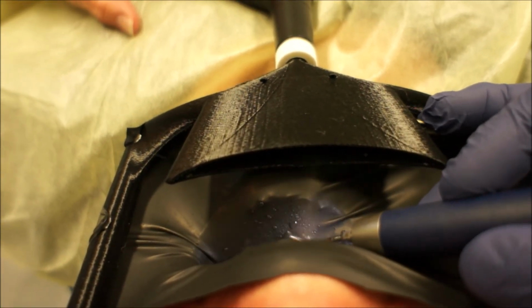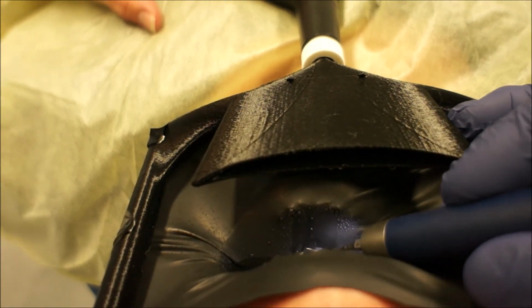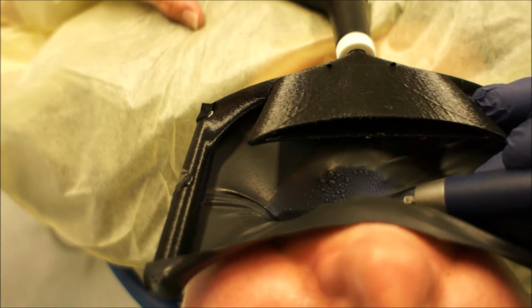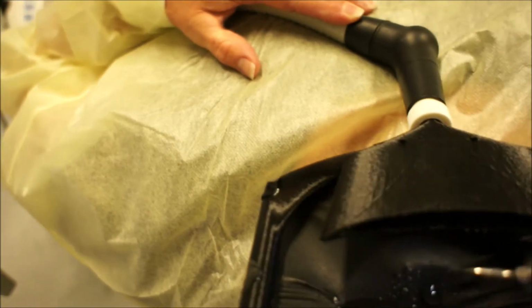However, that's better. With the real chin and lips, the position is a lot better. The clamping I've done here, I think it was on the upper first molar, and you can see how it landed just below the nose. Like that, and then you'll have the top of your frame maybe just a wee bit above the tip of the nose. If you've set up everything and you see, oh my word, it's still up there, what I usually do is just take a scissor and cut a little scallop there to clear the nose.